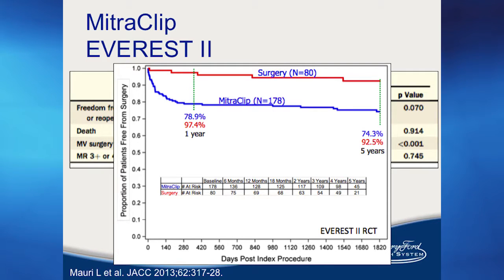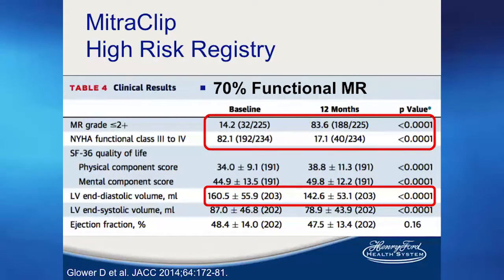All right, so I talked about treating mitral regurgitation, mostly degenerative, with the clip. There are some people treating functional MR, mostly in Europe. There was a randomized study in the United States for it, so we can't say that we do that yet. But what I just wanted to show you was that it does work. Maybe not as well as some other things, but these patients were able to have reduction in their mitral regurgitation and as a result, they did have remodeling of the LV chambers.